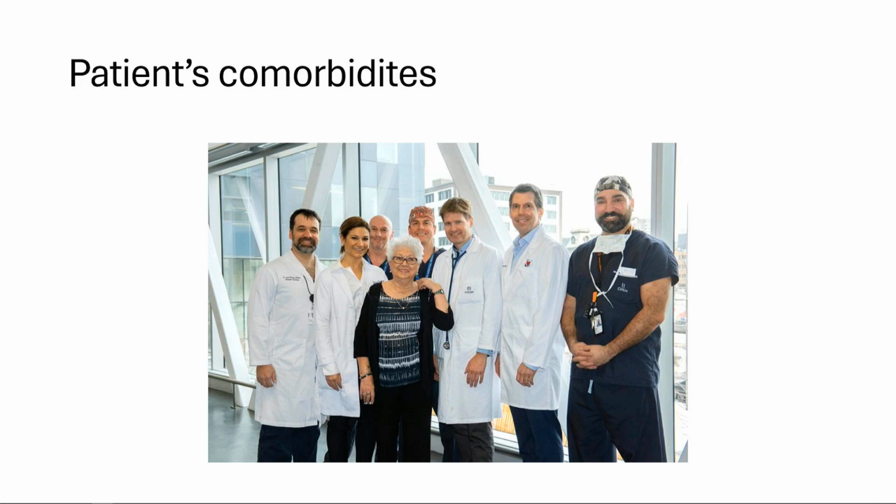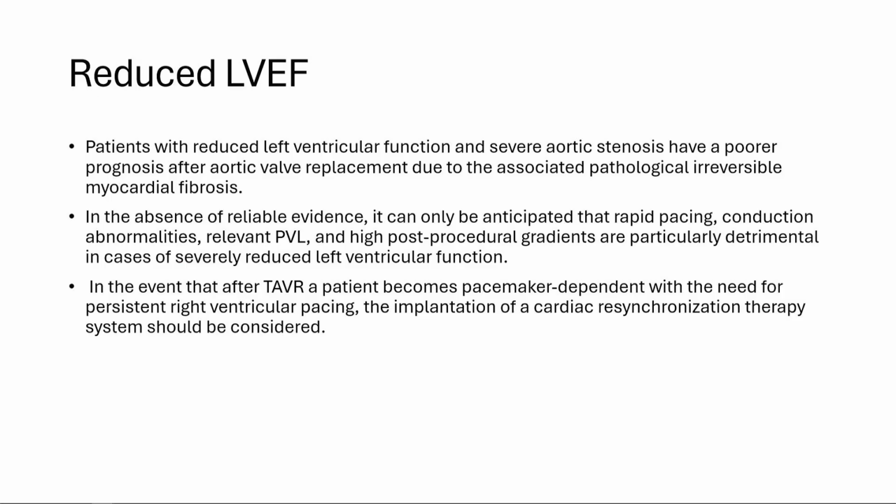Now we're going to start, after talking about the anatomical consideration, we're going to talk about the patient's comorbidities. Patients with reduced LVEF and severe aortic stenosis have poorer prognosis after aortic valve replacement due to the associated pathological irreversible myocardial fibrosis. In the absence of reliable evidence, it can only be anticipated that rapid pacing, conduction abnormality, relevant PVL, and high post-procedural gradient are particularly detrimental in cases of severely reduced left ventricular function.